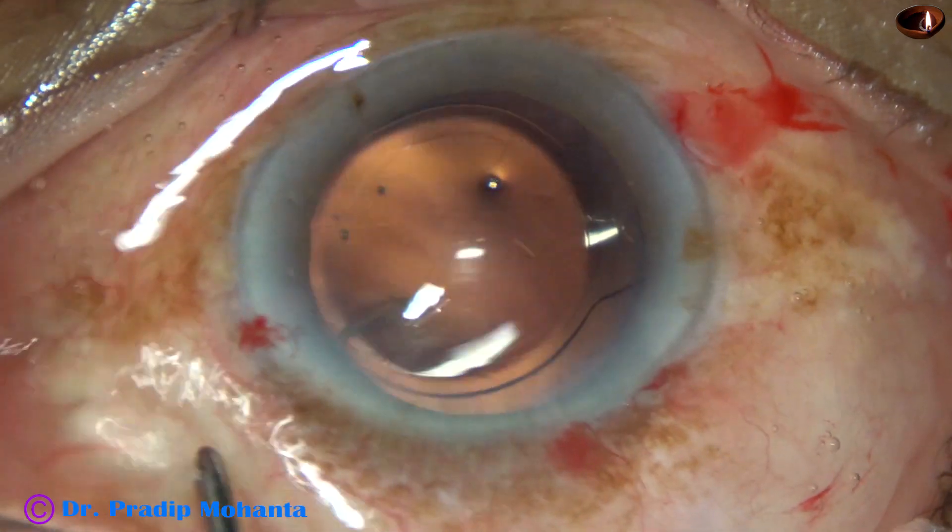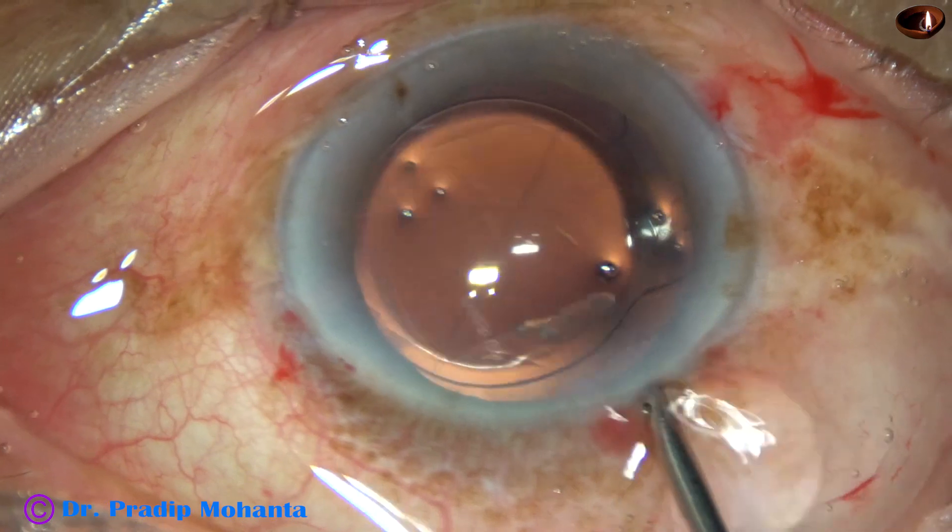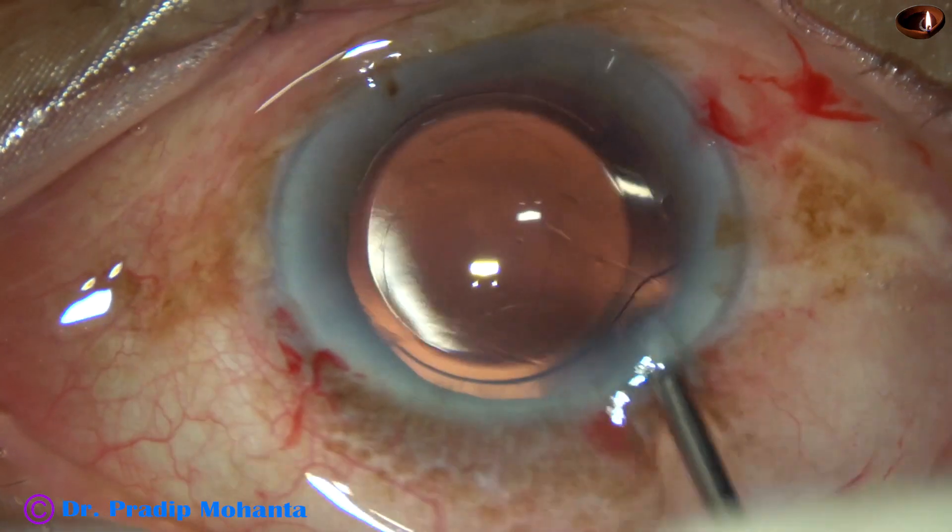There is some amount of lens matter — yes, it has come out.